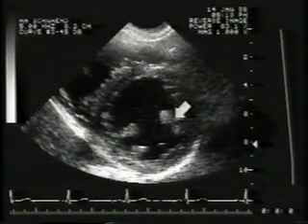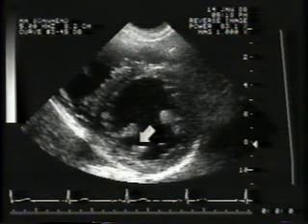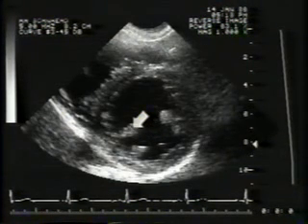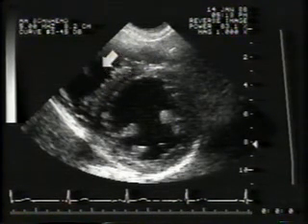This is the anterolateral papillary muscle, and this is the posteromedial. Note that for this subject, the posteromedial papillary muscle has two separate heads. The ventricular septum lies between the left and right ventricles. Note that the right ventricle is incompletely visualized.